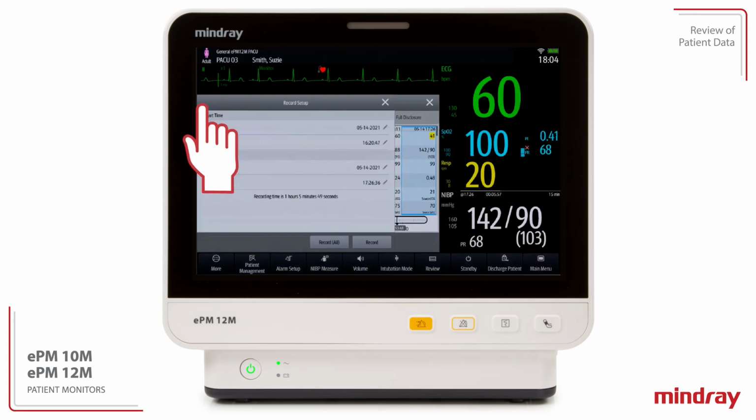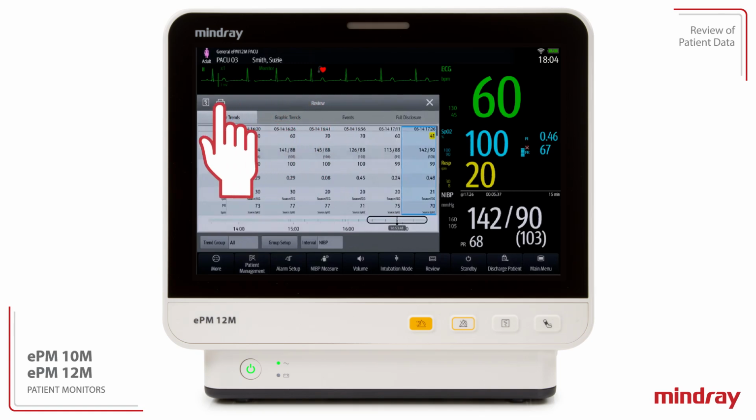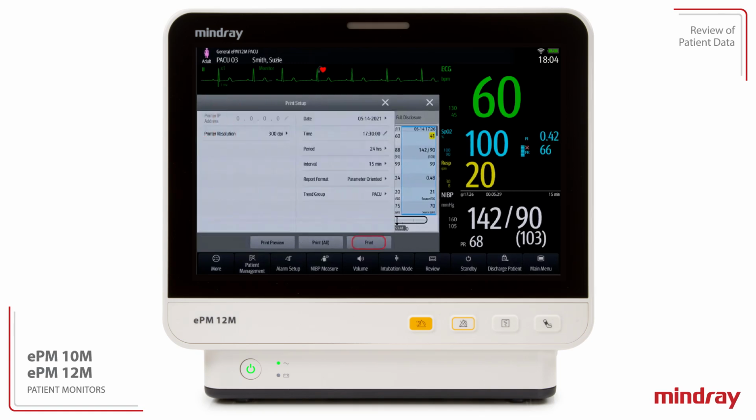Select the Record icon in the upper left corner of the Review dialog to print tabular trends to the integrated recorder. Select Record for trend data between a specific start and end time, or Record All to print all trend data at the selected interval. If configured, select the print icon in the upper left corner of the Review dialog to print tabular trends to a designated laser printer.